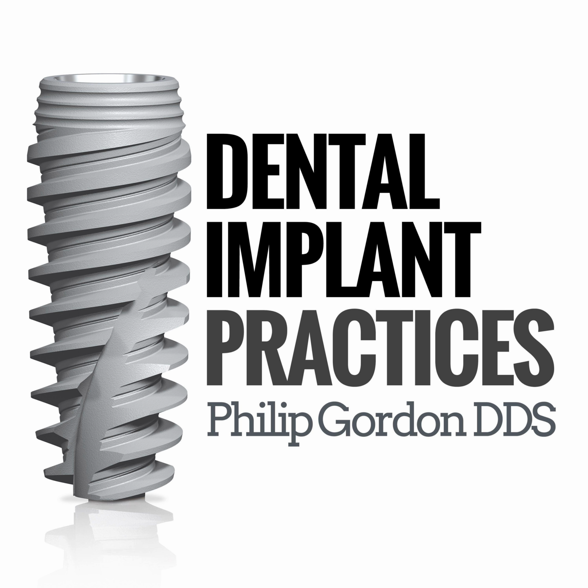And so that's kind of why I like to stick with a product line that has interchangeability there, so that each time I'm placing or restoring an implant, I'm not necessarily starting from scratch on my inventory. So that's something to think about when sticking within a product line.